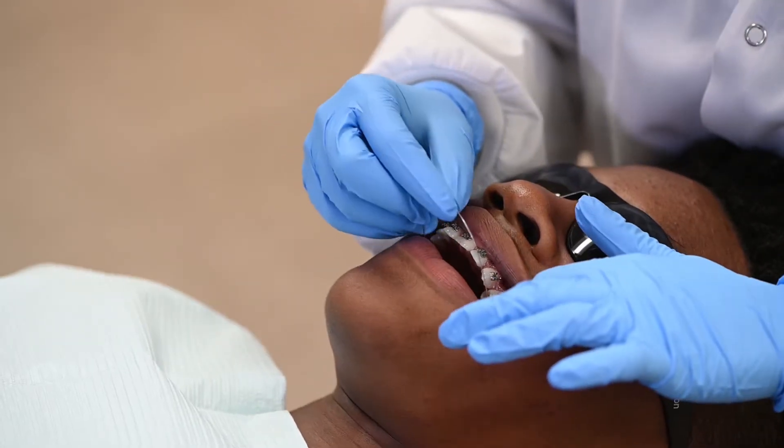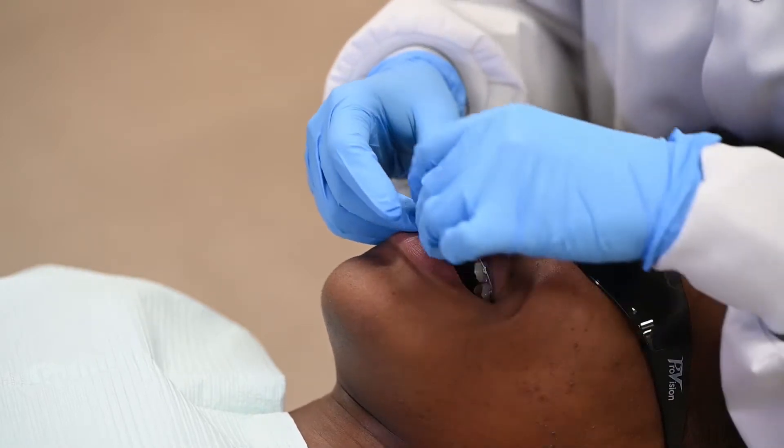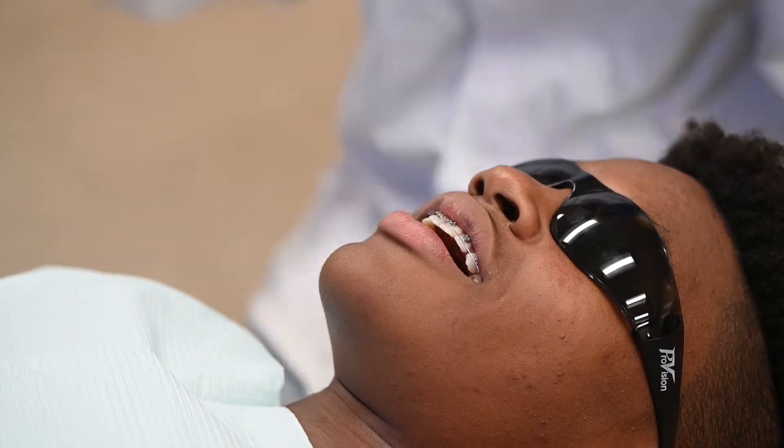The next step is to attach the wire that connects all of the brackets together. This wire is what controls tooth movement from here on out. We will replace the wire at upcoming appointments as the teeth move.